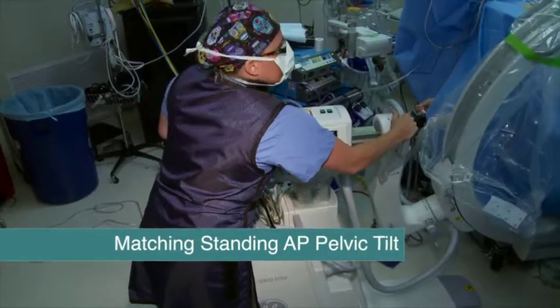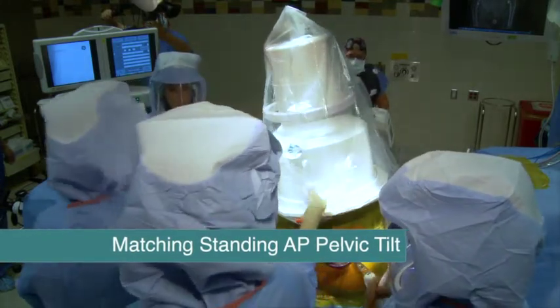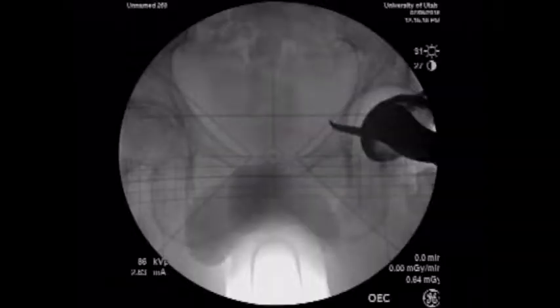So I start by adding some tilt and just guessing so that you can give the patient a little bit more of a halfway between an inlet and an outlet, and then we're going to try to match the patient's standing AP pelvis tilt. Gosh, our rainbow looks pretty good right there, huh? And I think that's a pretty decent grid shot, and actually it represents our tilt pretty well because, you know, that trans-teardrop line is above the symphysis, top of the symphysis.